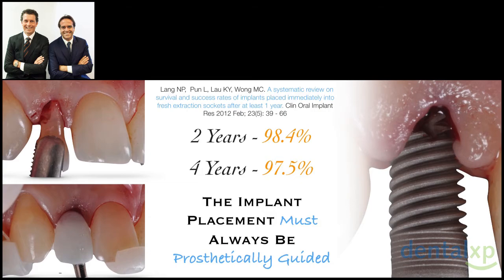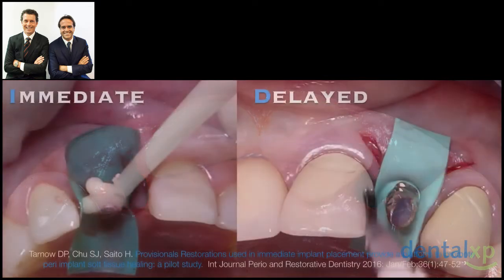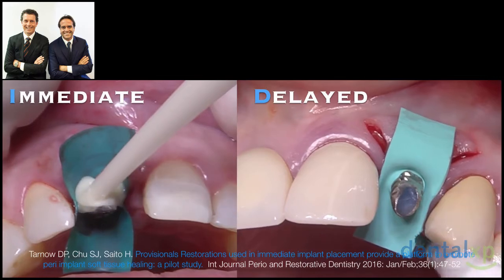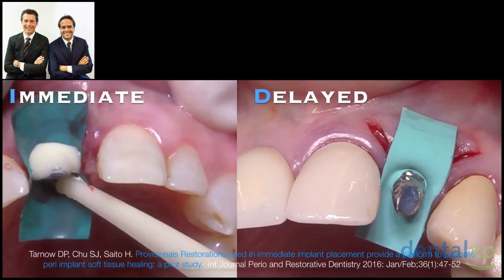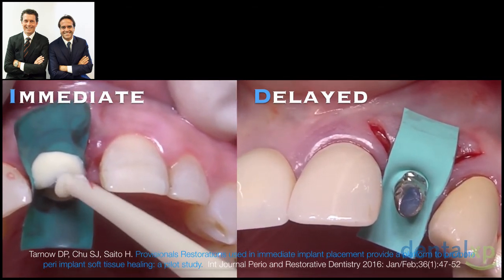And this is the final situation at the end of the surgical protocol of this specific patient. But when we discuss immediate implants in the aesthetic zone, we will always need a protocol which is a combination of a surgical procedure and prosthetic procedures. And despite having two different anatomical sites, the prosthetic management does not change, protecting the surgical site with a rubber dam and relining the provisional restoration shell directly in the patient's mouth in this case.